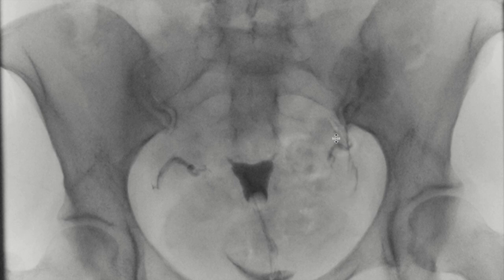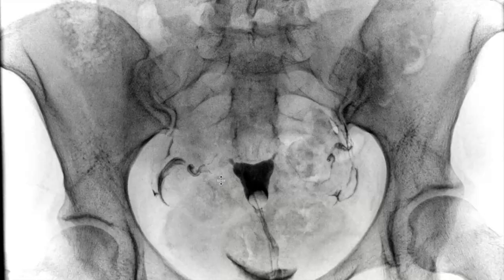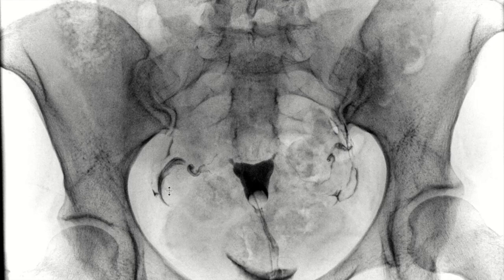You establish patency on both sides — on the left we now have spillage into the peritoneum, and then eventually on the right you can see this spillage as well. So this is a normal appearing hysterosalpingogram where you have patency of the fallopian tubes on both sides.